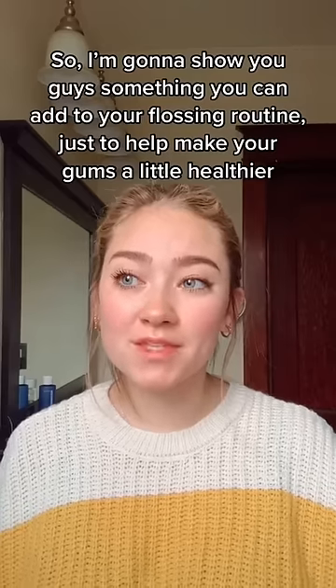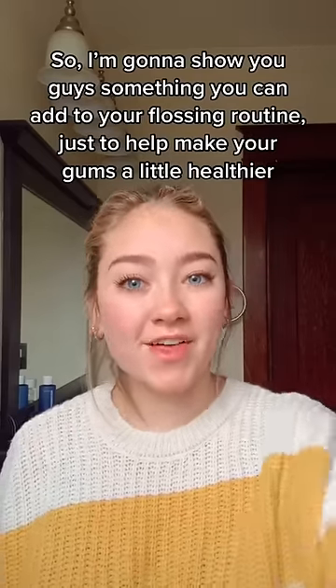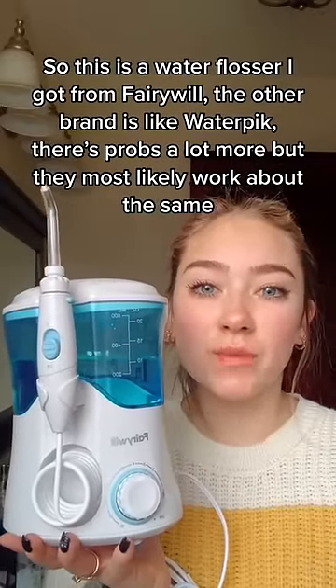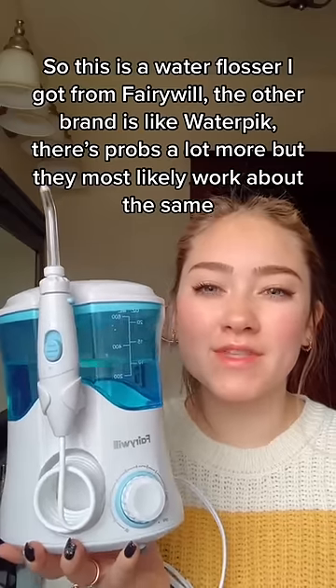So I'm going to show you guys something that you can add to your flossing routine just to help make your gums a little healthier. This is a water flosser — I got this one from a brand; another brand is like Waterpik. There are probably so many more, but they all work probably around the same.